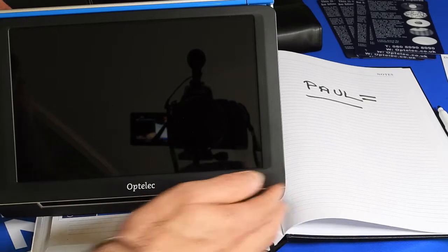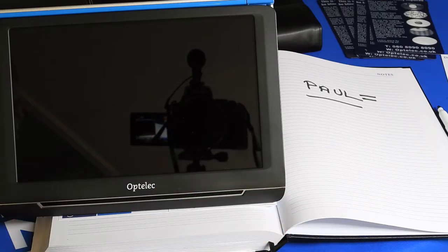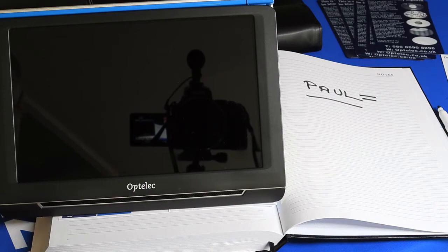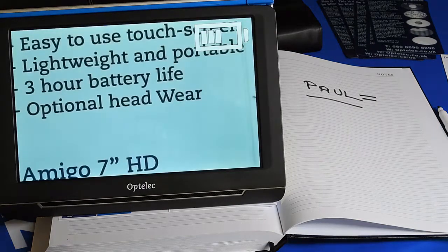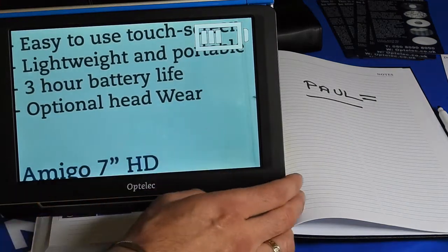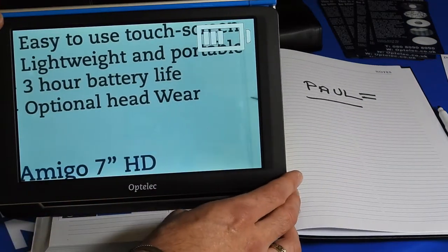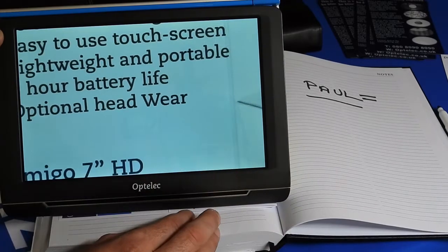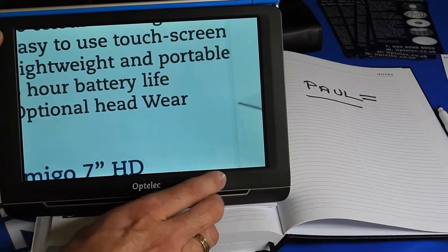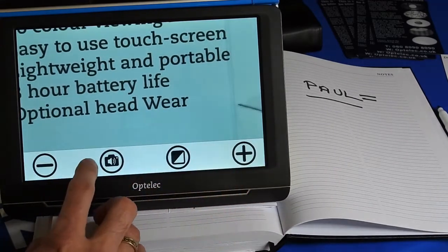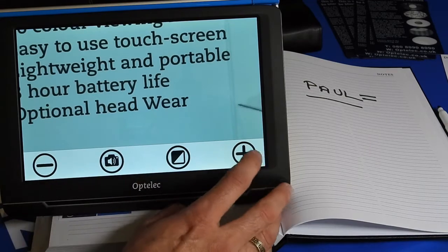So here today we have our Compact 10, which is a 10-inch touchscreen with a haptic feedback touchscreen. Quite simple to operate - touch the screen and it will show you a range of buttons on the bottom.